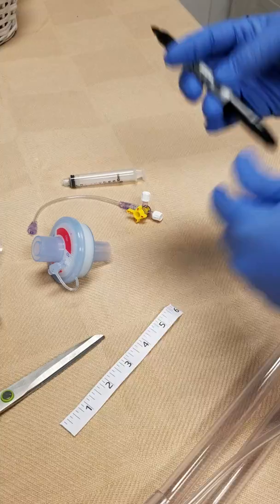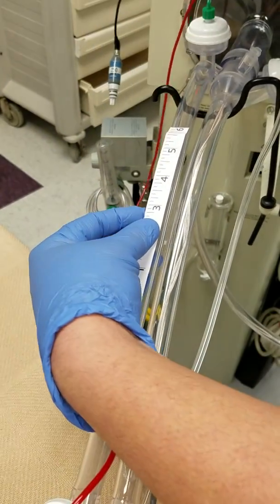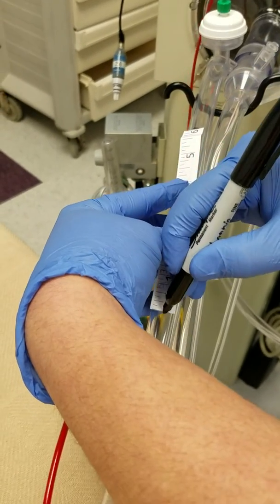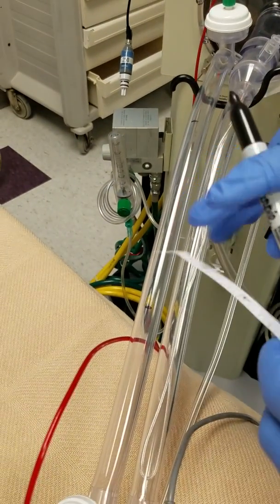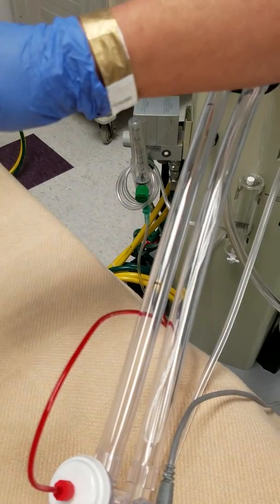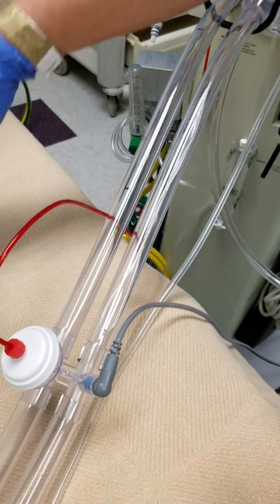I'll go ahead and mark my line just to have everything ready. I'll leave a little bit over the edge right here — I'm going to cut it right here and right here. It's best if the circuit is not on the patient yet when you do all of this. But if the patient is already on it and you want to convert, this is also the best way to do it.